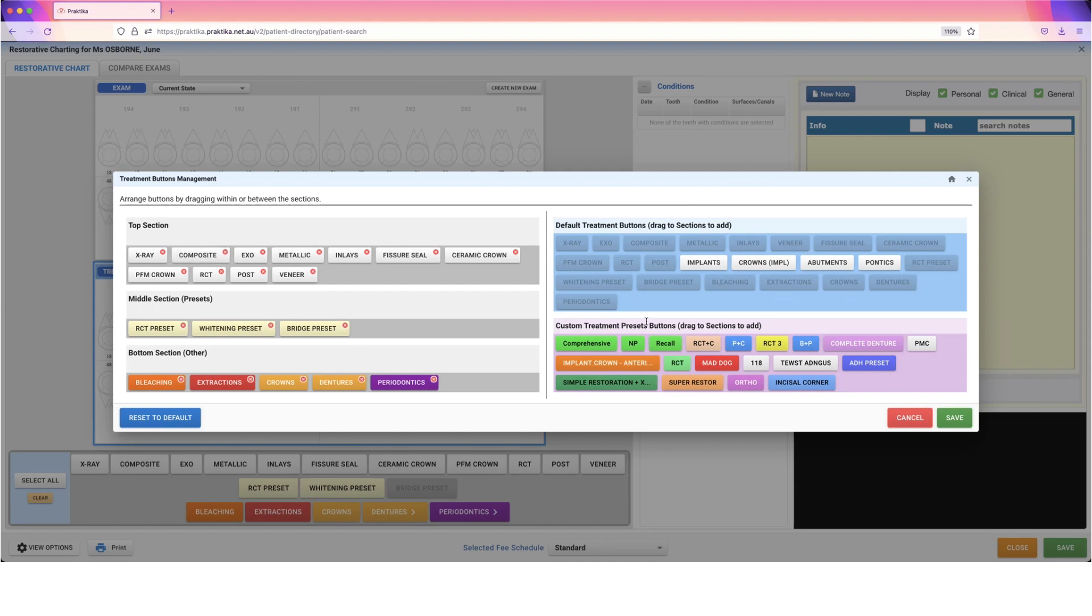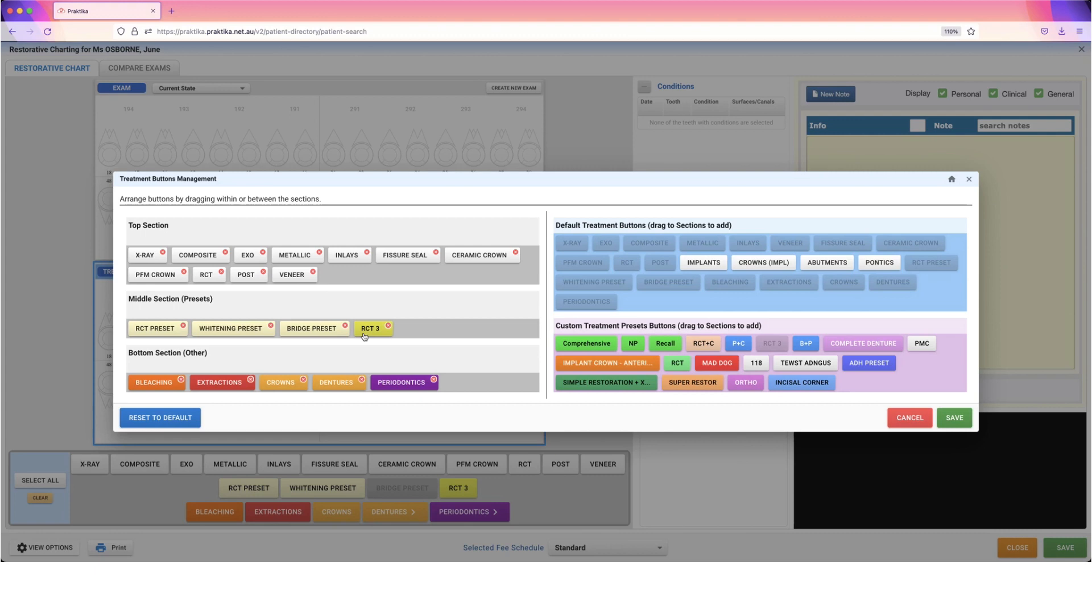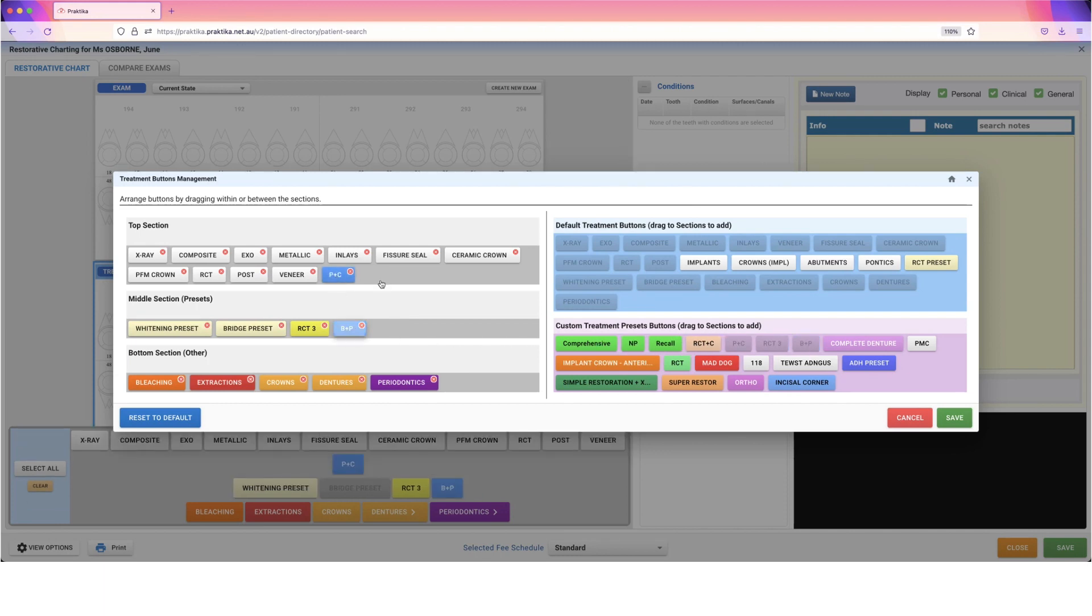You can also create your own customized treatment preset buttons. I'll show you next where you can do this, but once you've got those buttons created, all you have to do is find them over here and drag them to the spot where you want them. I've just put in a root canal three-visit that I created myself. I'm going to get rid of the standard root canal preset because it doesn't fit my practice. I can add in my post and core, band and pin.